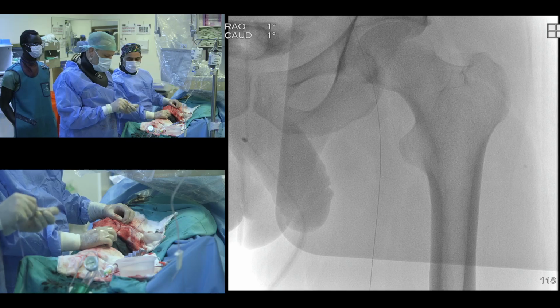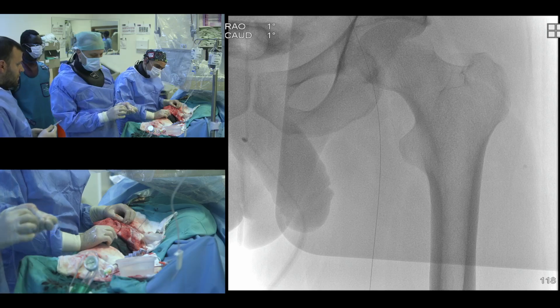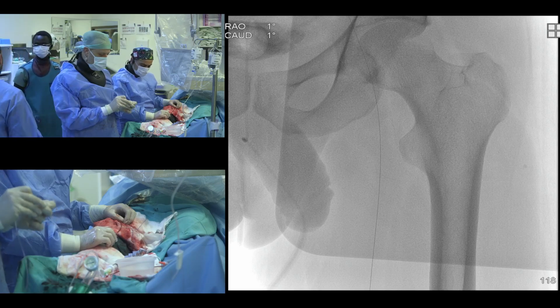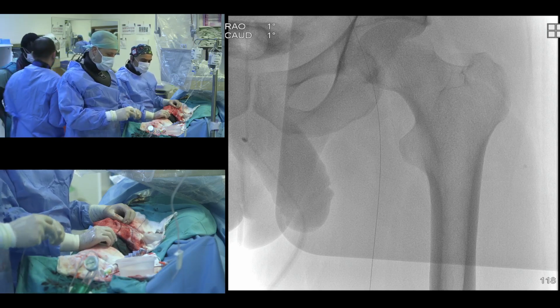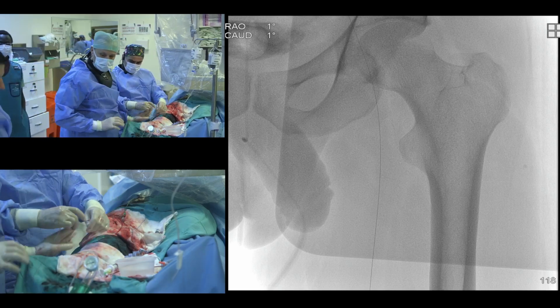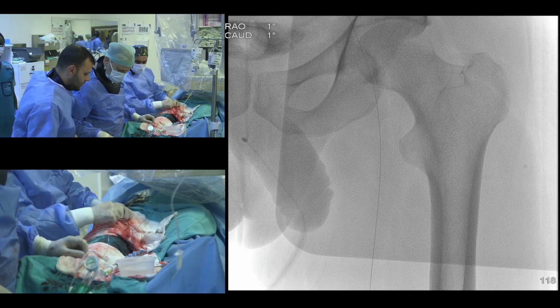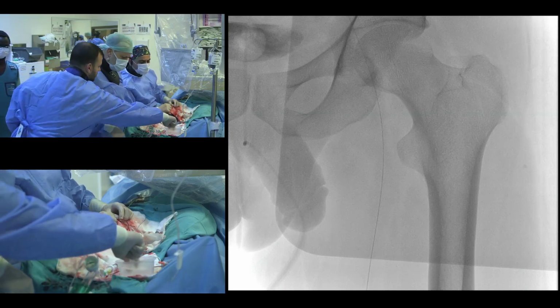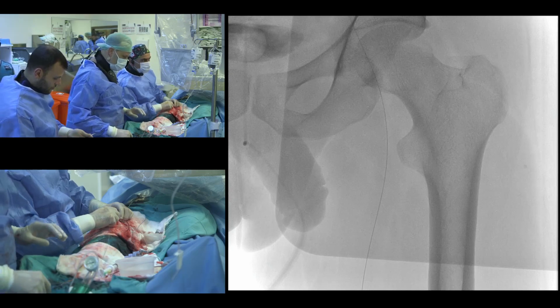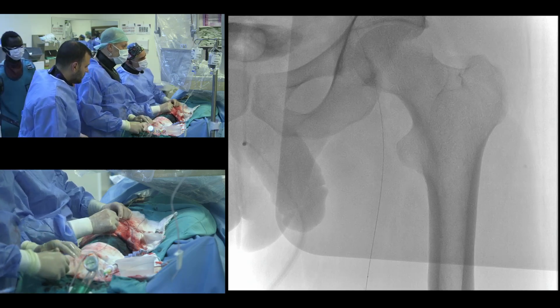I think the operators perform a great job. We know that the Burger disease is very different than the atherosclerotic disease. The vessel is full of the thrombotic tissue and also the fibrotic tissue. And in such case, we usually expect a distal embolization after the plain balloon dilatation. So, Dr. Ersan, in your clinical practice, you usually use the distal filter for the protection or not? No, not a distal protection device in my practice.